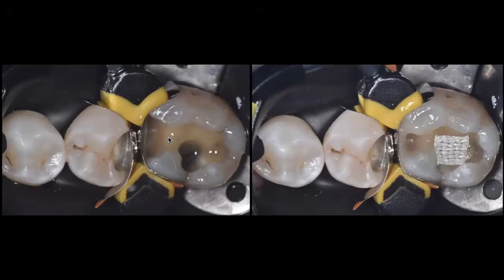Every time you have a deep margin, you want to start by placing a horizontal layer that goes from mesial to distal, from gingival to about 2 millimeters of height in the occlusal aspect. Make sure that you tap on it and condense it nicely. I take my time because it's critical that this first layer is completely adapted to the floor of the box. I'll show you how that goes when I start restoring the premolar, because in this case it was a little bit complicated.